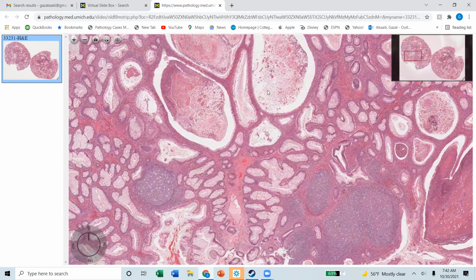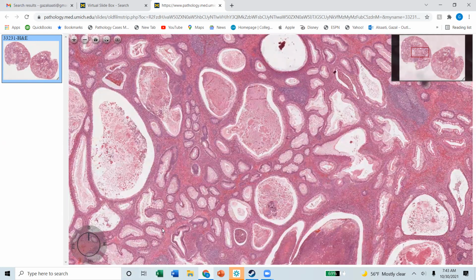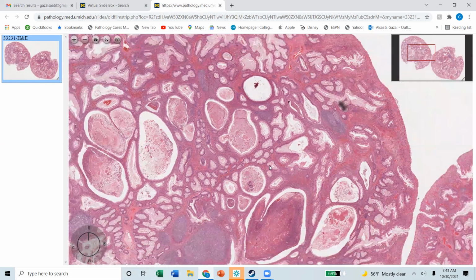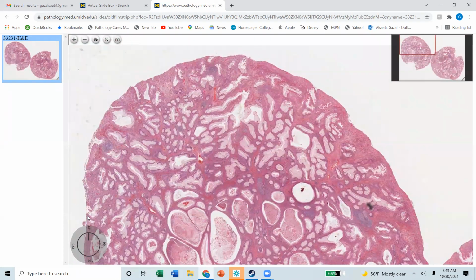And what it tells you is that hyperplastic change here. It's just the mucosa gets edematous around the cystically dilated glands, and the surface has to be round. Look at that. Okay. This is the difference between a hyperplastic polyp and a juvenile polyp or retention polyp. Your surface is the giveaway.